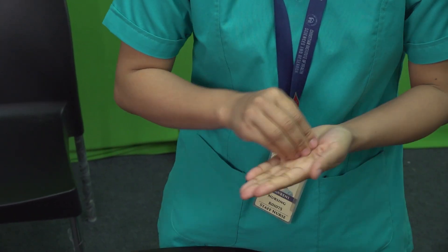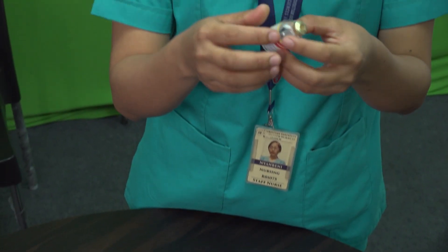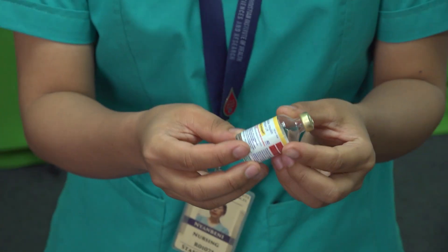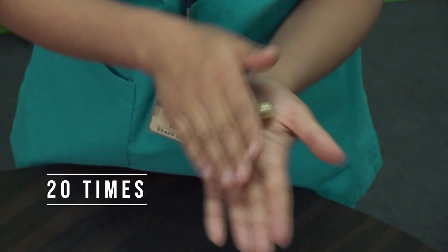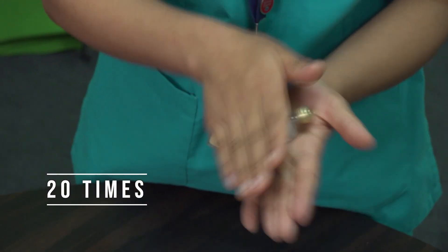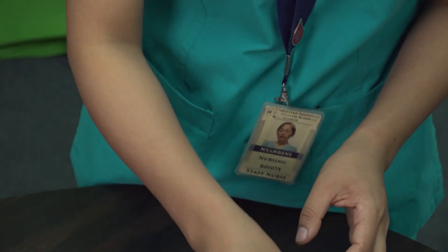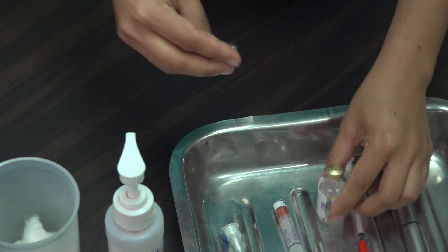Check the insulin vial for any signs of clumping, discoloration, or crystal formation — if present, do not use it. Gently roll the vial between your palms to mix the insulin evenly. Disinfect the top of the insulin vial using an alcohol wipe or cotton ball.